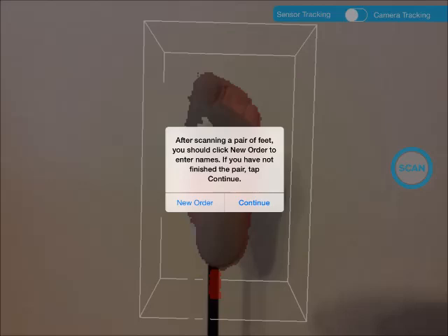After saving files, or when you are not satisfied with the previous scan, you need to tap the back button. When you do that, you are prompted to answer a question: new order or continue. If you have finished scanning the pair of feet for a person, you choose new order. Otherwise, you choose continue. If you choose new order, you will go through the whole process from entering names to making scans. If you choose continue, you just need to choose left or right foot. You do this until you finish your work.